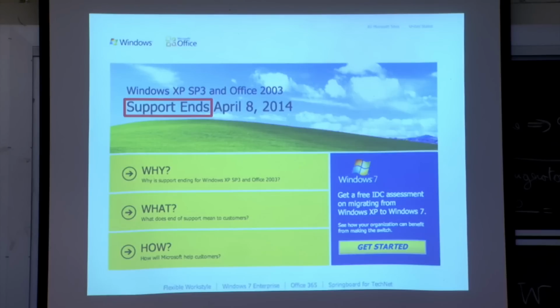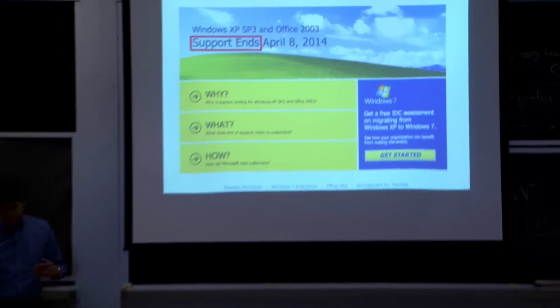If you're used to downloading updates for your open source software on a daily basis, well, think about medical devices. You might not be able to get to it, say, for a year. It might be in the field for 20 years. So it's very difficult to locate software that's appropriate for a 20-year life cycle. It's basically flying in space.